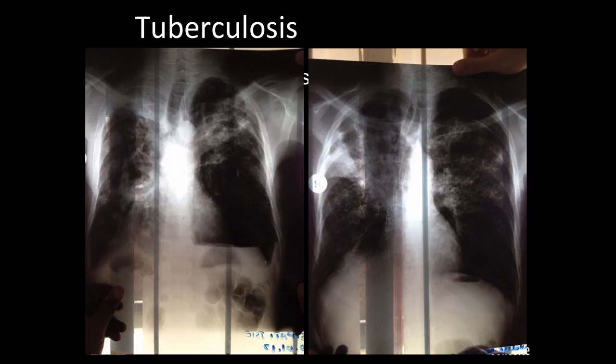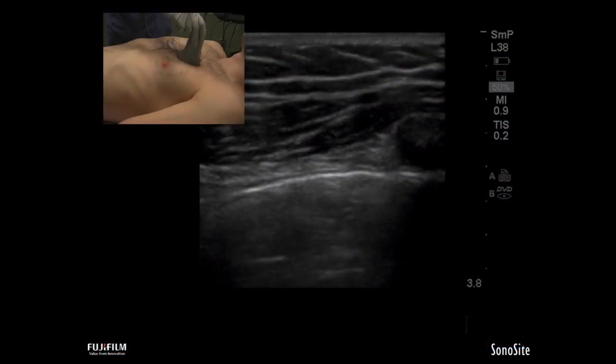And in these patients, for example, here are some chest films from a TB hospital for XDR and MDR TB patients in Maseru, Lesotho. We can see lots of blebs, chronic scarring, and focal consolidations, among other problems.